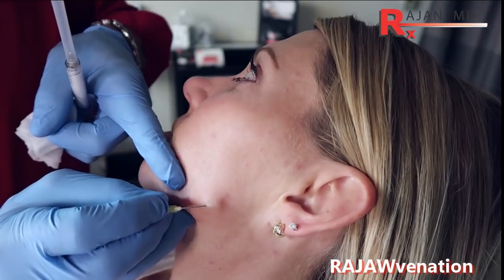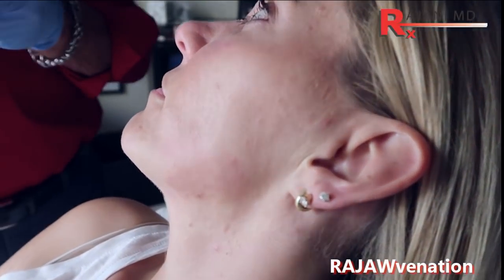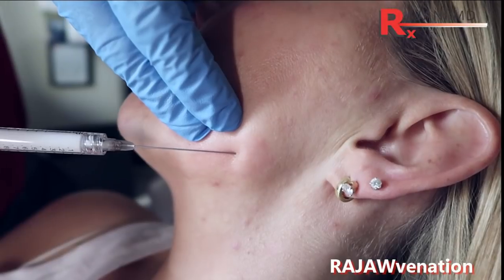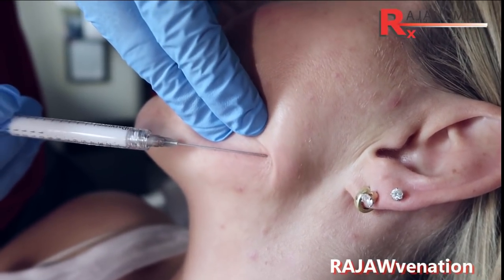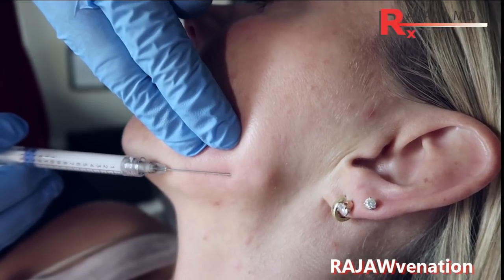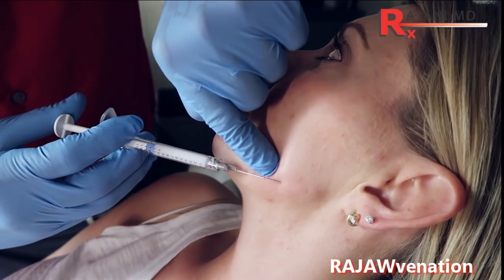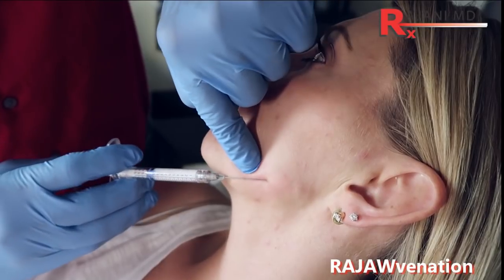Today we're addressing the posterior. Here we're creating the opening and using the 22 gauge cannula — we used a larger needle to create the opening. Finding where we created it and coming in with the cannula, not injecting here because there would be too much product superficially, but advancing the cannula. A lot of times there's no pain for the patient because most of the pain fibers are superficial. Now we can start injecting product — that creates a potential space, making it easier to advance the cannula. Injecting and pulling back in a retrograde fashion, following the natural contour of the jaw to create that volume.